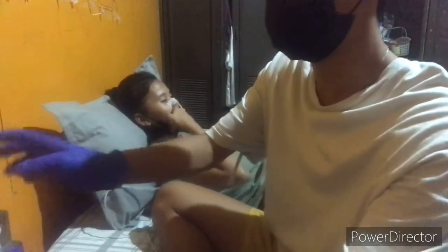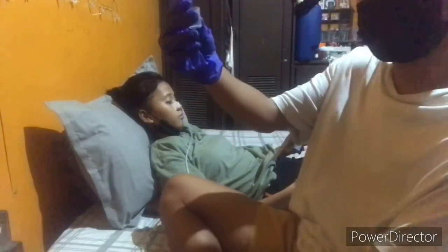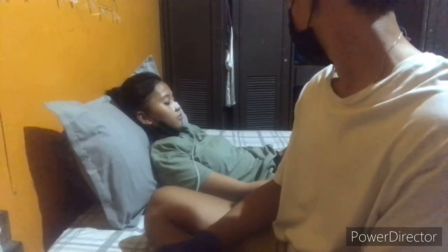Advance tube feeding gradually. Tube feedings should be advanced gradually to prevent diarrhea and gastric intolerance to formula. When tube feedings are not being administered, cap or clamp the proximal end of the feeding tube to prevent air from entering the stomach between feedings. Administer water via feeding tube as ordered with diluted formula. This provides client with a source of water to help maintain fluid and electrolyte balance. Rinse bag and tubing with warm water. Rinsing bag and tubing with warm water clears old feedings and reduces bacterial growth.